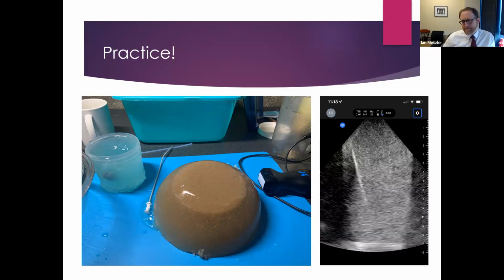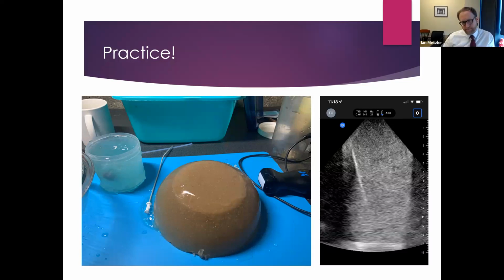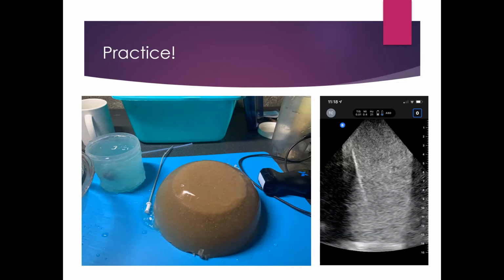Yeah, please. Yeah, as I said previously, we don't have that much exposure for this ultrasound guided PCNL unless we only use this ultrasound to insert this nephrostomy tube during the obstruction. Otherwise, even during our residency, we were doing this standard PCNL with fluoroscopy guidance, other than using the ultrasound.